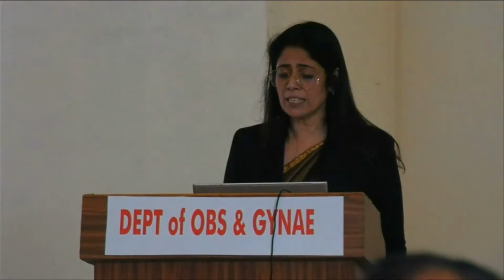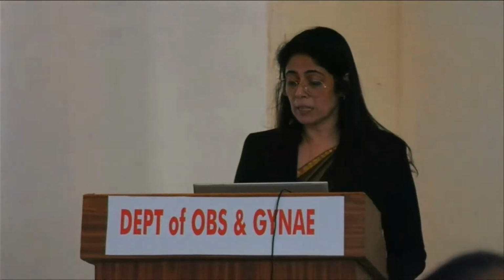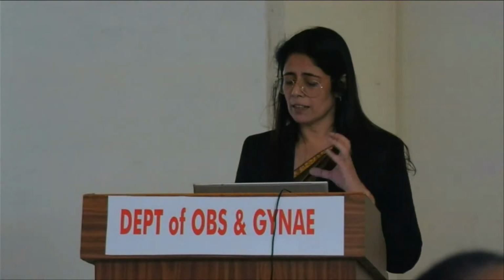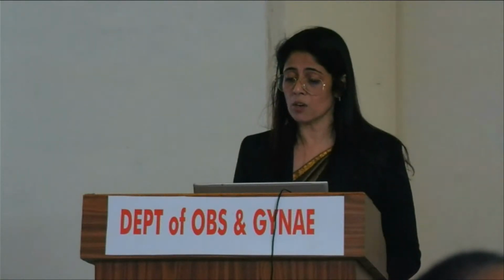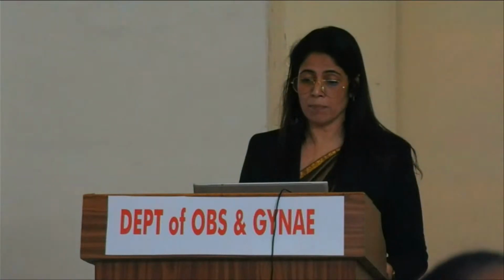So every plane is important. And also look at the fourth ventricle, because sometimes the fourth ventricle might be dilated when there are posterior fossa cysts, which is an early marker for posterior fossa cysts, or sometimes the fourth ventricle might be effaced when there is open spina bifida.